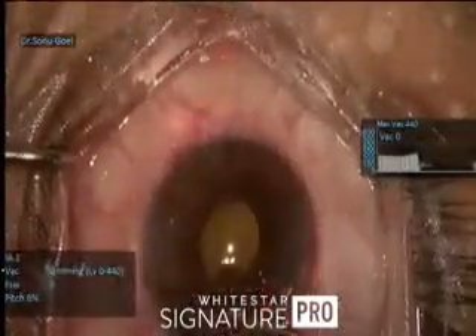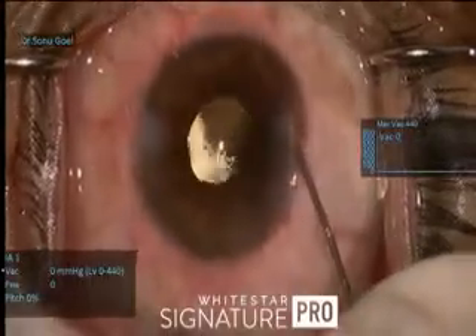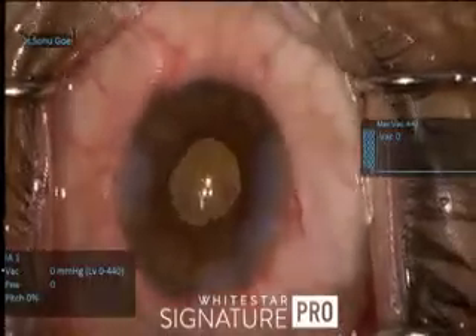You can make out the floppiness here. And this is how the final picture looks. Thank you.